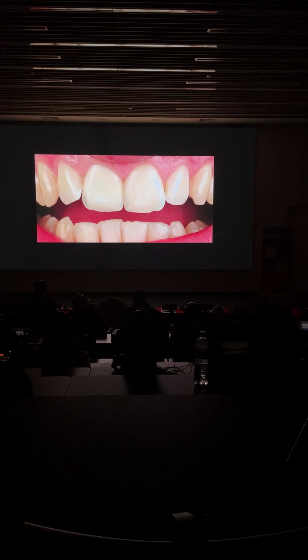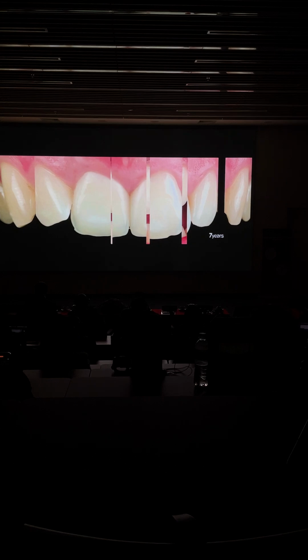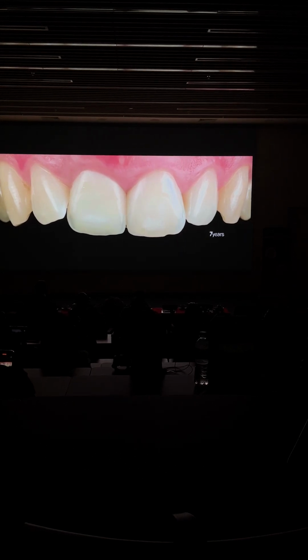You can see that the volume of the papilla is shorter than when we started. But this is 7 years down the road. You can see I put too much soft tissue. You remember I was telling you I put way too much tissue on the buccal, but you can see how the tissue is coming down and is filling on the buccal. Okay? You can see the leveling of the papilla.